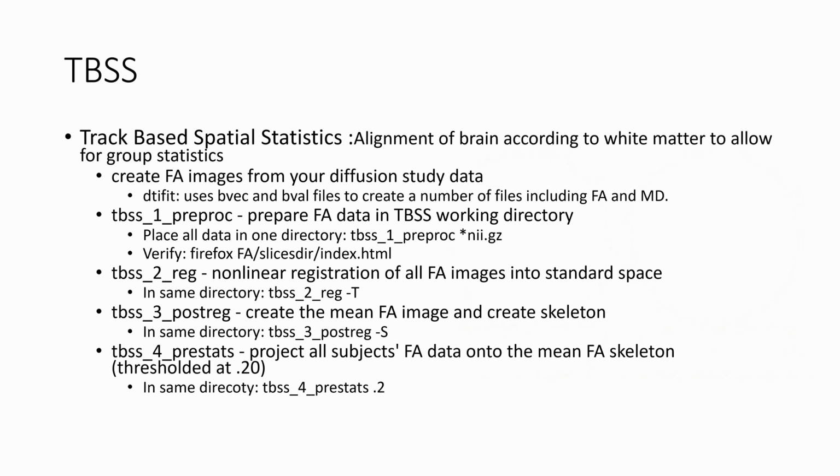I'm going to skip a little bit over just the basic measurement of FA in DTI fit. I think you're hitting a little bit of DTI fit on the Friday. It's very easy to use. You throw in your diffusion NIfTI file, and you get a measurement of what kind of a sphere fits over, how elongated it is, what your eigenvectors are, and Tom spoke about that a little bit last time, where your strongest eigenvalue goes across, and you get your mean diffusion, and you get all these nice little metrics out.